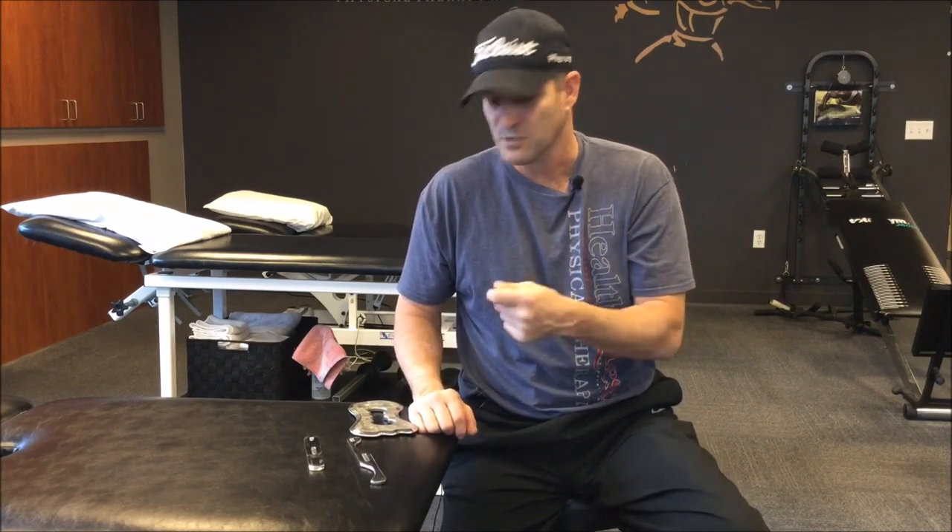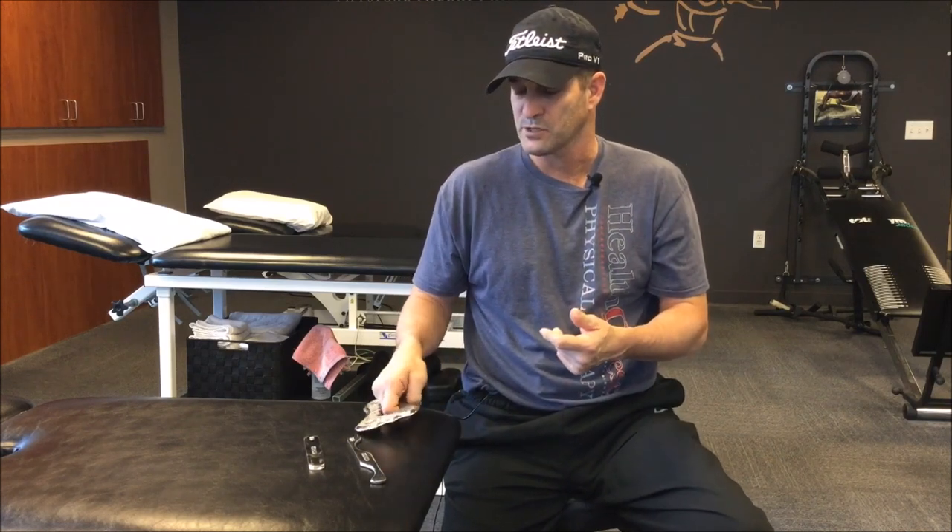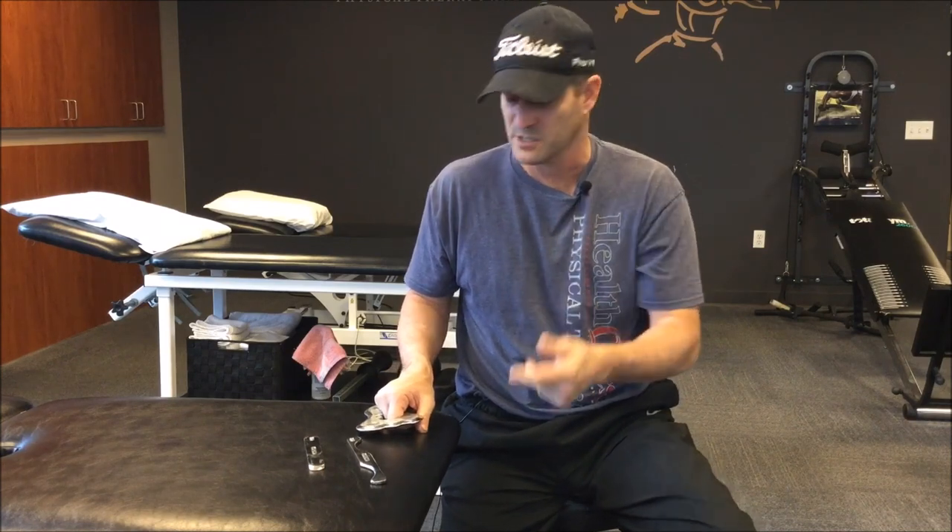Be very careful when you're applying Graston because it can be very uncomfortable. That's why I always tell my therapists to make sure they do it on themselves so they can know which areas — bony prominences and certain soft tissue areas — are less tolerable to pressure. It's important that you use them on yourself to make sure you can be effective and not cause too much discomfort.